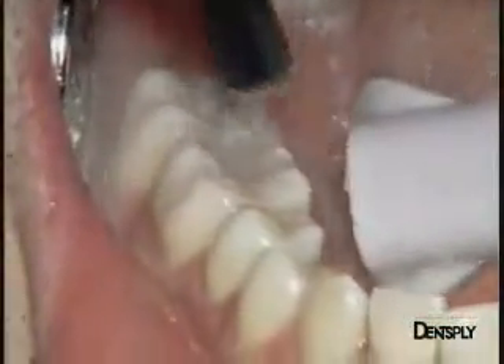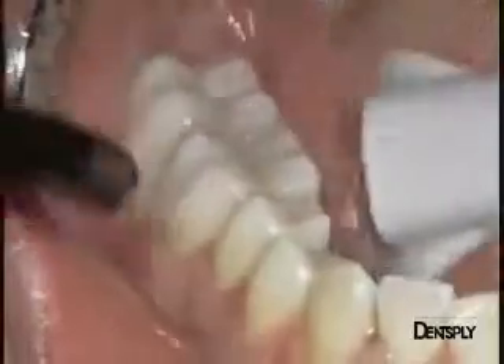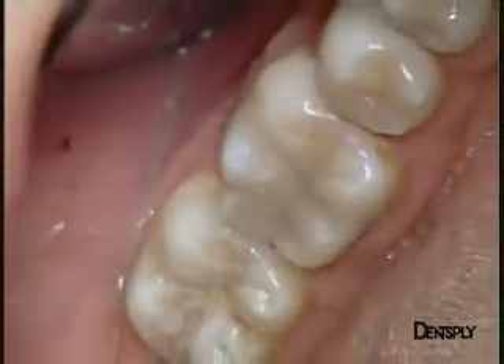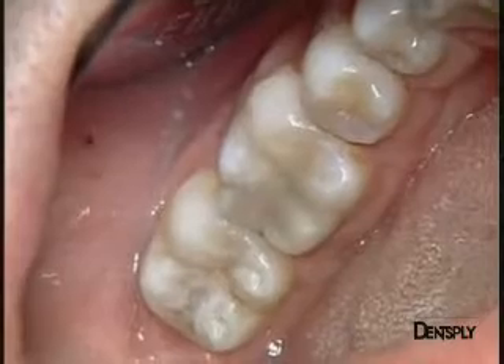Intensive rinsing removes all the remaining polishing paste, and we see now the good anatomical integration of our restoration. The difference in shade between the tooth and the restoration that you can see at this stage is merely due to the dehydration of the dental tissue.